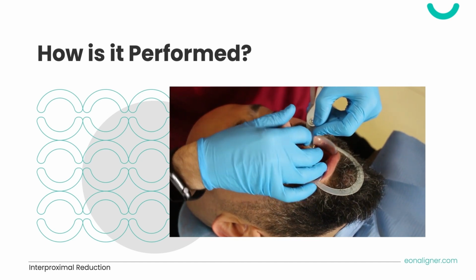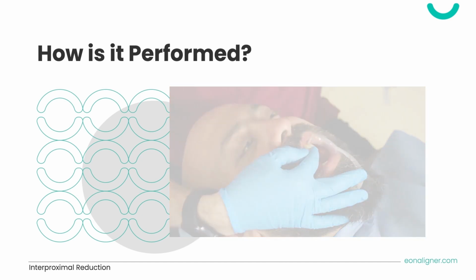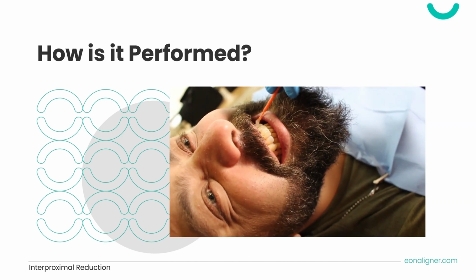Don't force it in. If it's tight, do more reduction. Lastly, apply fluoride varnish to avoid post-operative sensitivity.